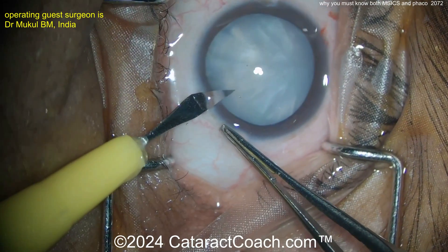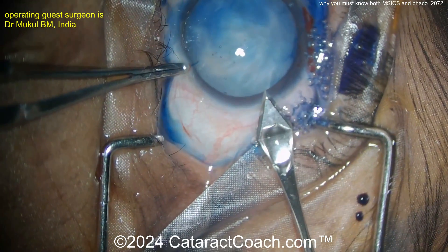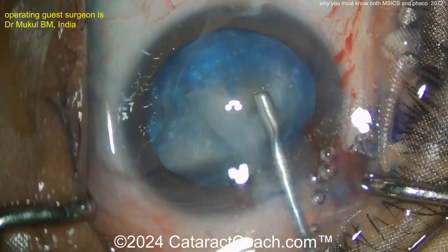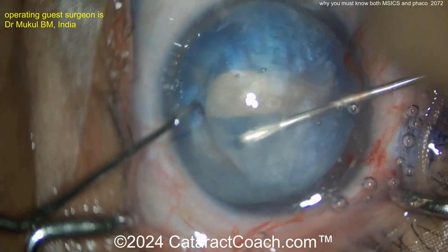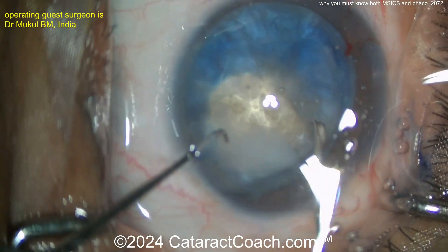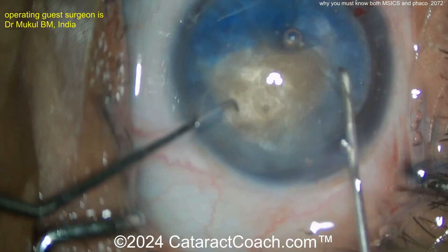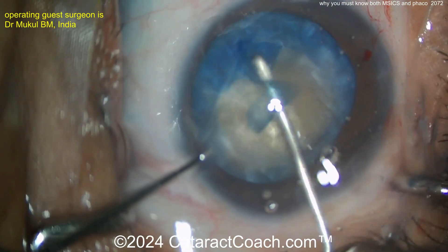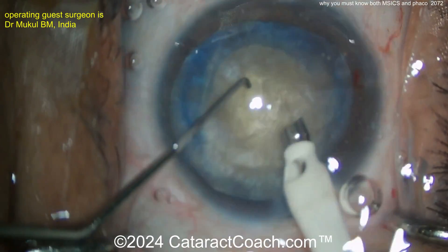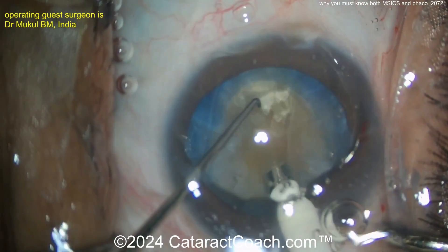Now look at this patient — very narrow palpebral fissure and also a highly myopic patient. Sometimes these myopic patients have thinner sclera, so in this case our guest surgeon is going to do phaco. Getting a good rhexis is important here. Look at all the milky fluid coming out — expressing that so you don't get an Argentinian flag sign, very nicely done. This nucleus is probably not super dense but has reasonable density; it's mostly opaque, very typical of an intumescent white cataract. The rhexis doesn't have to be as big because you can use the phaco probe and chop it in the capsular bag.